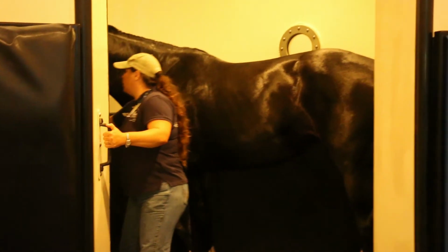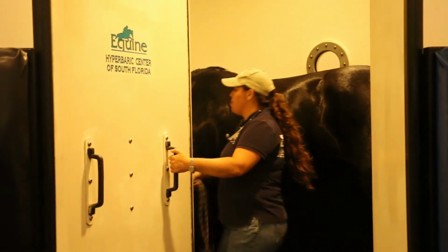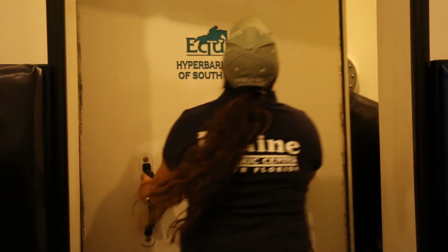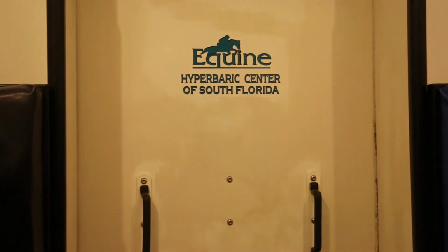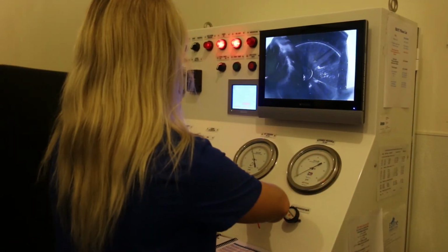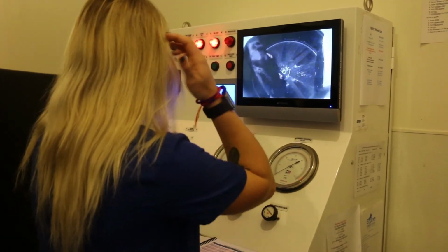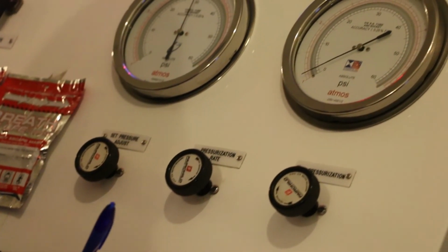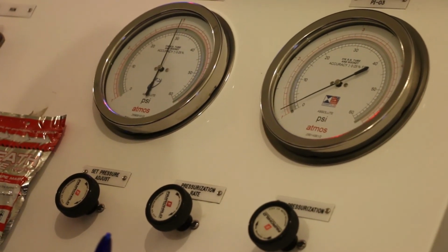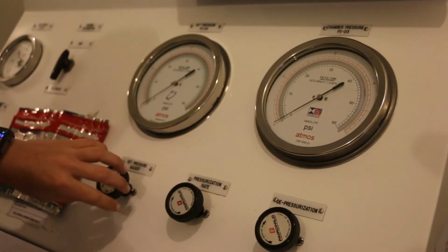There are very few horses, even fractious horses, that don't respond well to the detomidine. If they do seem to not be settling down, we slow down the descent, the pressurization. And if there's any behavioral issues whatsoever, if the horses for whatever reason are not happy, if they seem to have inner ear problems or any other issues, we'll bring them to the surface and take them out for any reason. It's too important to maintain safety to risk any kind of behavioral problems in the chamber.